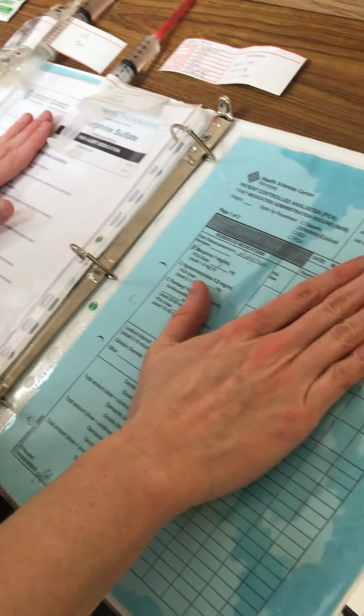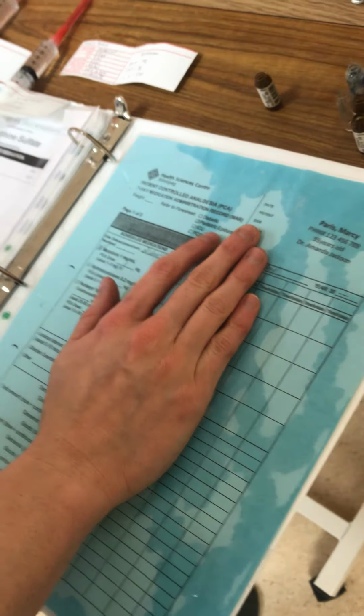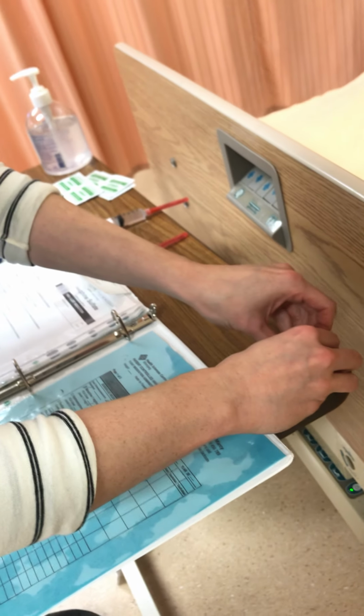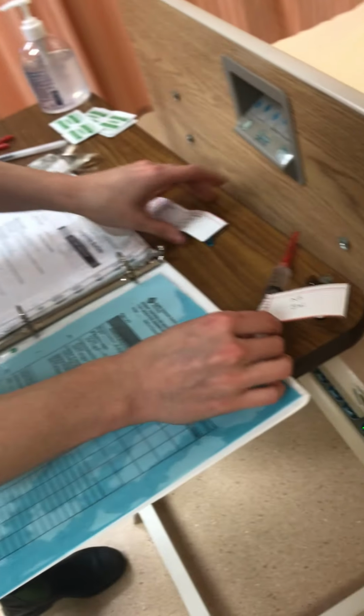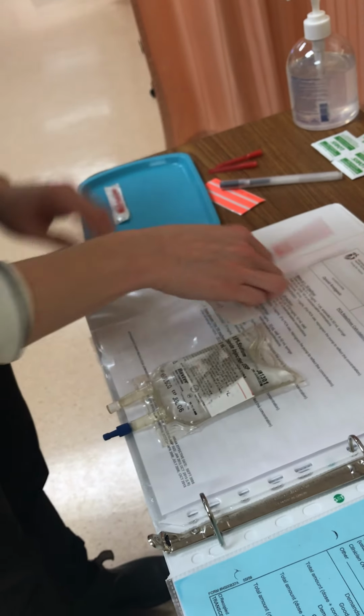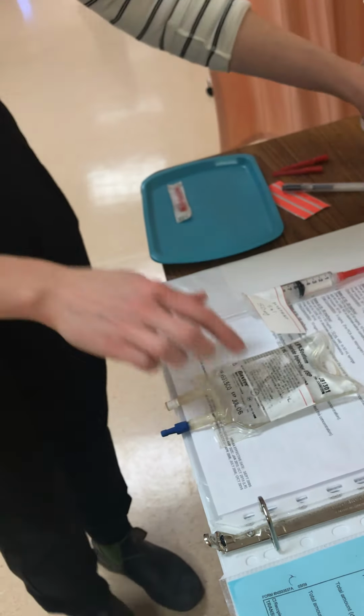It is a medication that's prepared for IV based off the parenteral drug monograph and the MAR, and I will be giving it via Curlin pump with this mini bag, and the time is now. So now I would grab my second nurse to sign off on my medication. I get her to sign this right here. If you want to sign, yeah, excellent, signature in. So at this point, I can put these in med waste. I put this away in the sharps container, and I can inject the morphine into my mini bag.